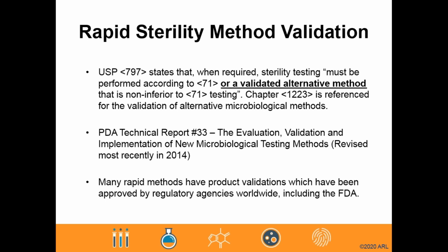The subsequent slides delve more into the parameters which have been assessed as part of a validation protocol based on the guidance in USP Chapter 1223 and PDA Technical Report 33.